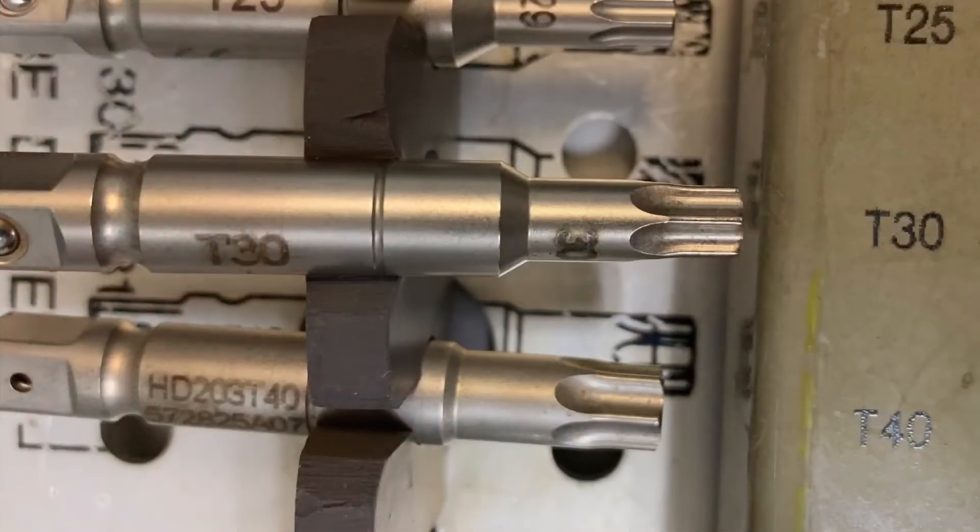The outer cap is a standard Star of David six-point screw. You can see here this is in the Synthes spinal screw removal set. For the outer cap it's a Star of David screwdriver — the name of it in the Synthes spinal screw removal set is T30. The outer cap is usually pretty easy to remove.